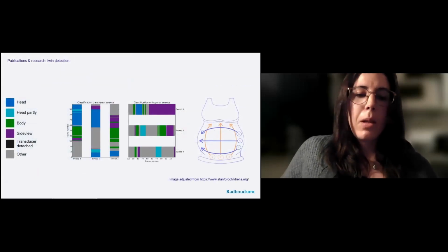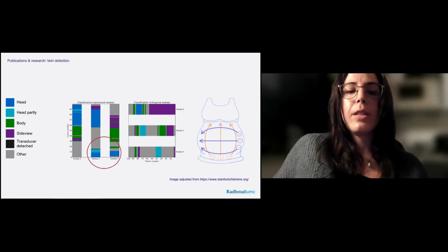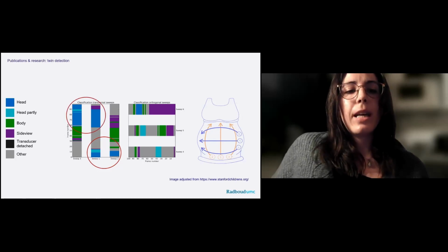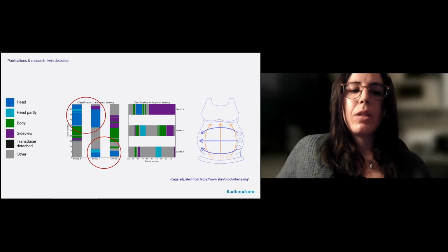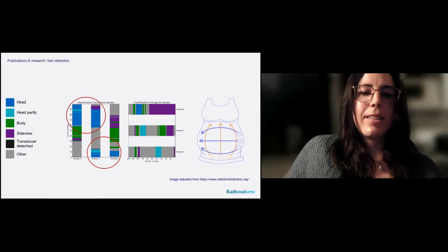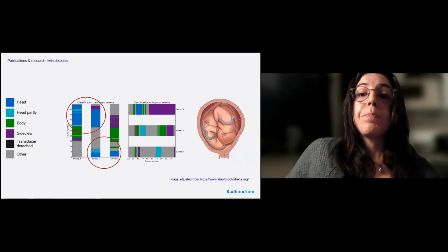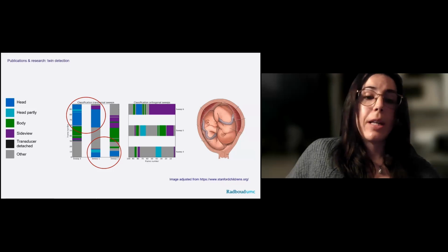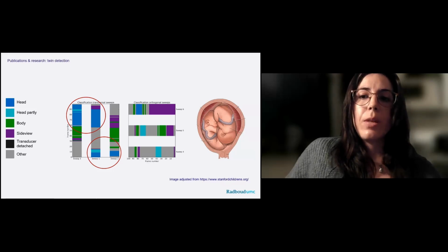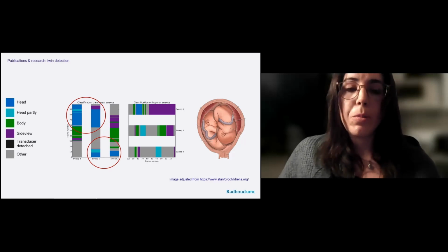For this task, the BabyChecker performed with 100% sensitivity and 99% specificity on a test dataset containing 31 breech pregnancies. And following the same logic, in this other case from another patient, we can see some frames of fetal head at the bottom of the abdomen, and some frames of fetal head at the top, and in between we see some frames of fetal body. So we can easily see that this cannot be the same baby. So we are in front of a case of twin pregnancies, where the fetuses are lying in opposite directions. This also constitutes a risk factor that we should identify in order to refer the patient to a proper level of care.